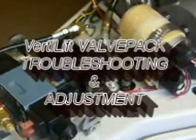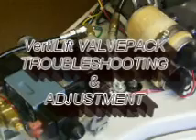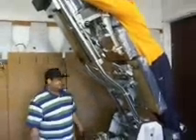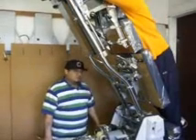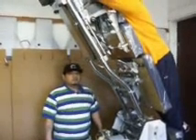Folks, this video has been put together to provide instructions on the operation, troubleshooting, and adjustment that may be required for the valve pack on the VertiLift. What we're going to do in this video is show a VertiLift table with a valve pack that is factory adjusted, and then alter those settings so that you can see some issues that could potentially arise out in the field related to the valve pack.